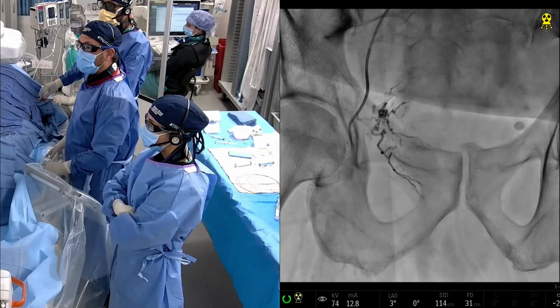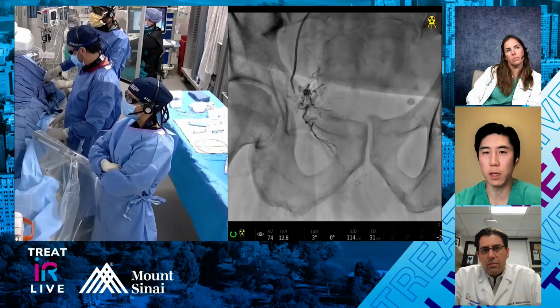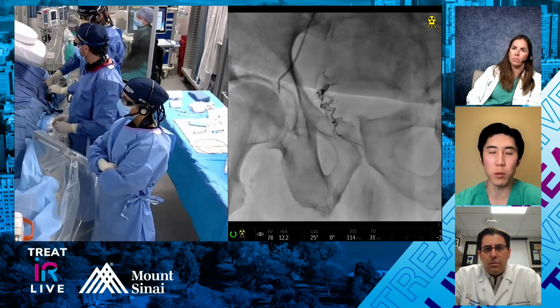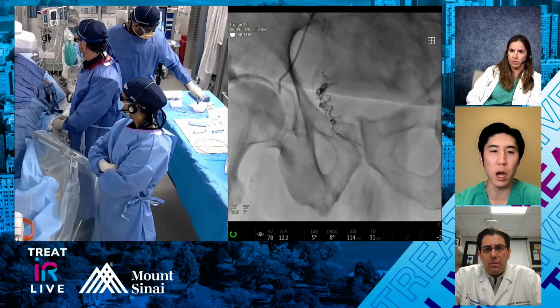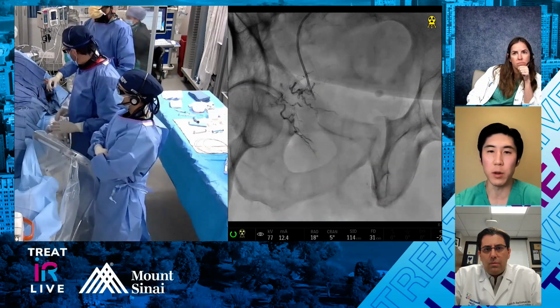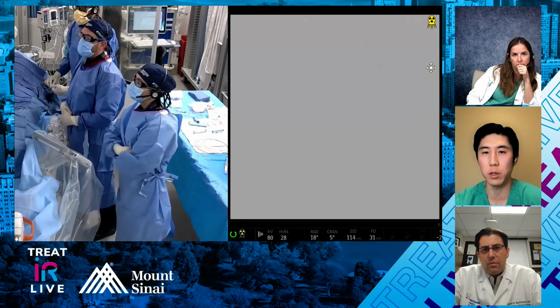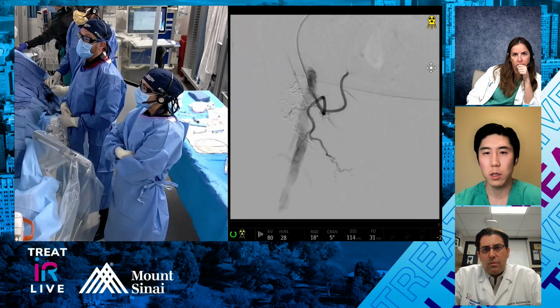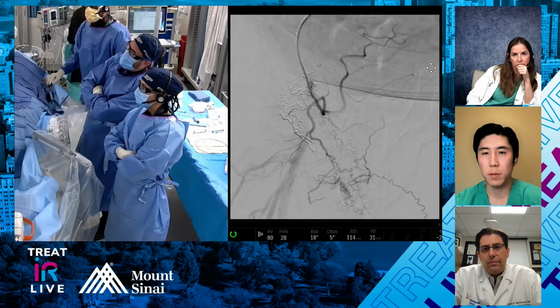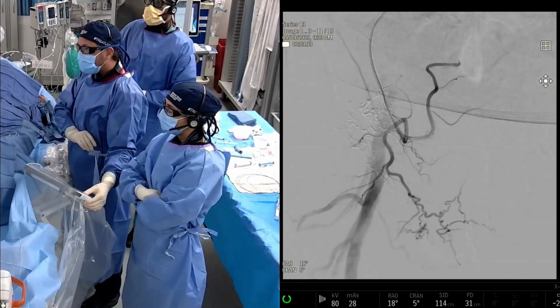Yeah, and Aaron, I think that's a really important point to investigate the replaced obturator. I think that's a very common origin for these prostates, especially if you get what's called the empty pelvis sign, where you do the hypogastric angio and it doesn't look like anything's going to the prostate. And if you don't see the obturator, it's a good indicator that it's probably coming off of a corona mortis. Good. So what we see here is not atypical in somebody with a pudendal artery occlusion.